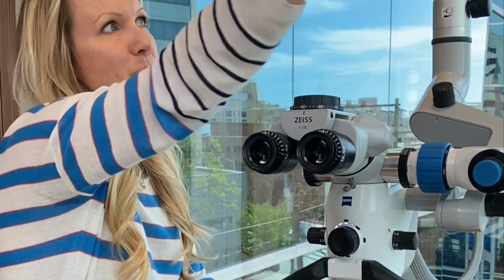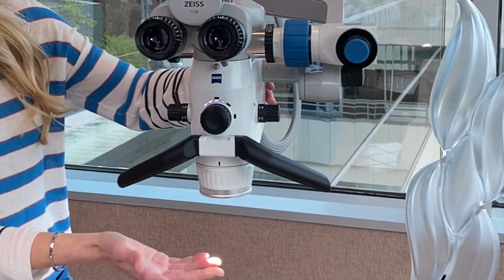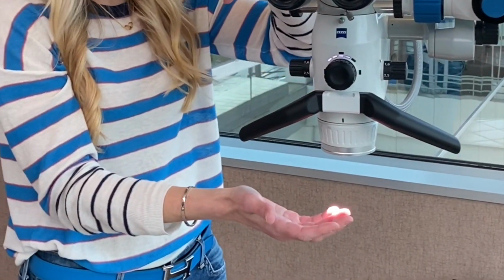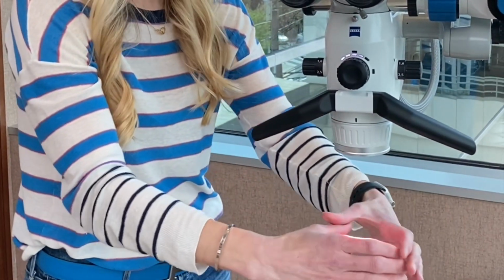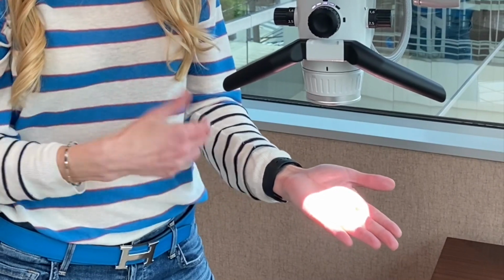Okay, let's go on now to the light source. So we're going to turn this on here. The light source is actually mounted either on a base, like a floor stand base, or a ceiling mount in a separate compartment. And you probably can hear it going now. There's a fan that's meant to cool that, and some of the mechanics in there as well. But it comes down to the suspension rod here, and it enters on a fiber optic cable right through the back of the scope here, right into the mid body. In this light source there are some prisms which direct it straight down through the objective lens into our field. And this is wonderful. It's called a coaxial or co-focal light source. What that means is it basically floods the field so that you do not get any shadows while you are working. It's just a really handy and bright light source.